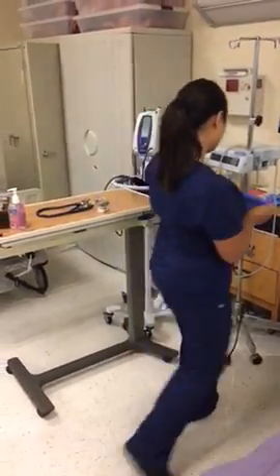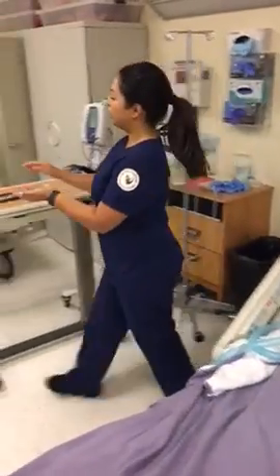I'm going to go ahead and dispose of my gloves and wash my hands. So I'm leaving the patient's room and I want to go ahead and document. I'm documenting their pre and post vitals, how she tolerated the humidity in her oxygen device, what liters per minute she was on, and the percentage that was on the large volume nebulizer. I also want to document any adverse effects that could have happened.